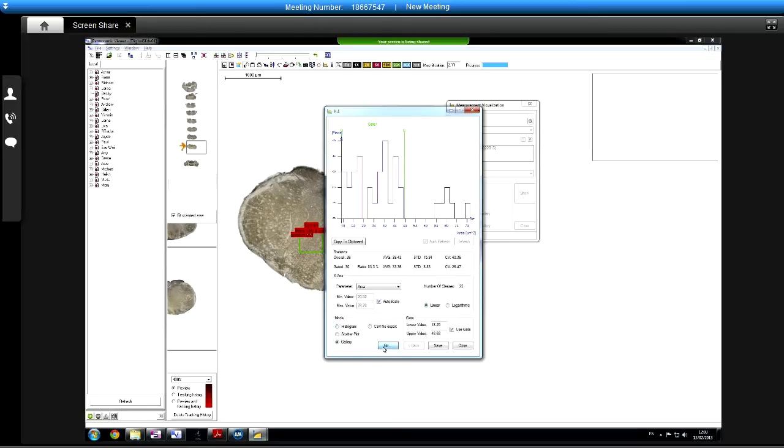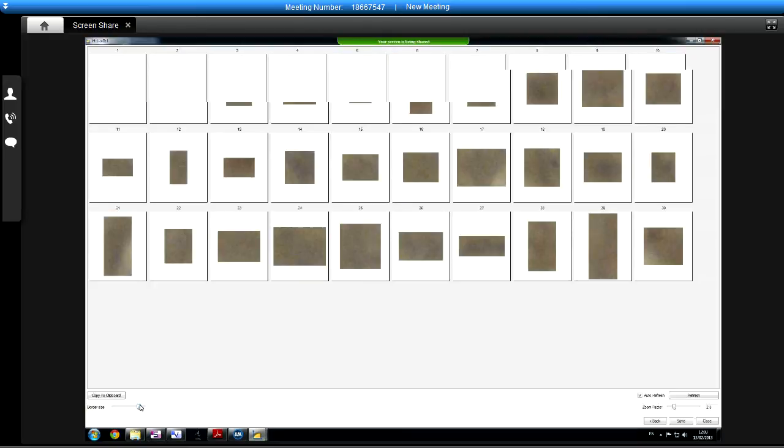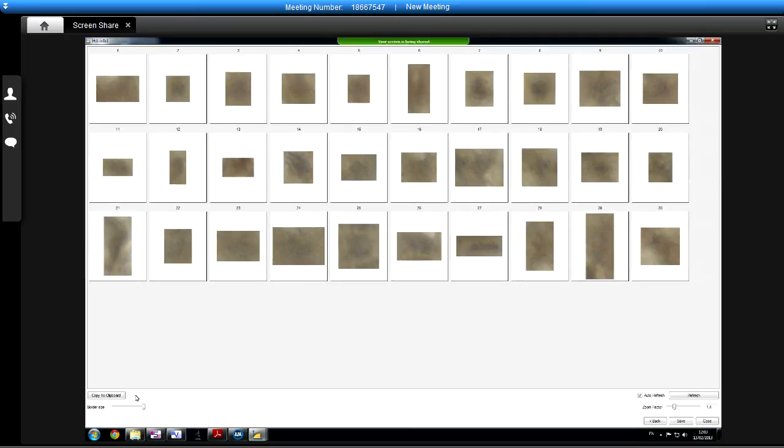So this is also useful if we couldn't get the training, so we were completely happy with it, but we knew the reality was that it was a certain size population in the middle, but in order to get it to detect them all, we had to put a wider range in. You can use this to gate down the data and say, I know you're counting all those, and that's the way I got it to work, but just show me the data. So you can go in here just to review it again.